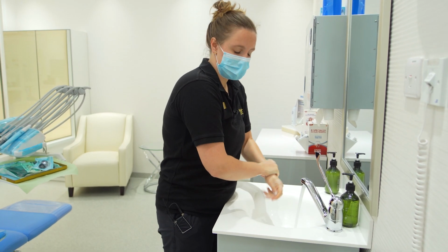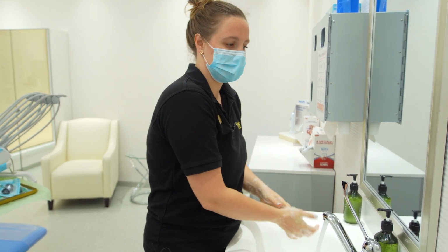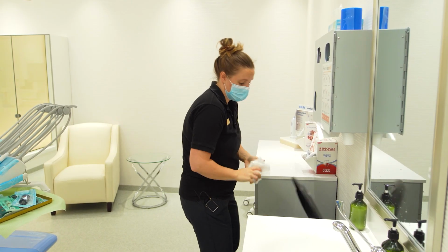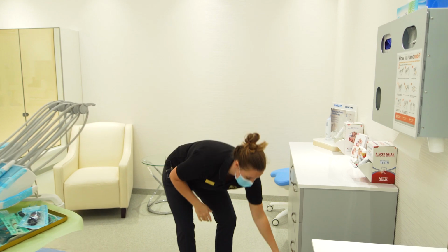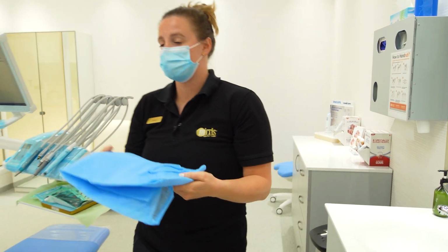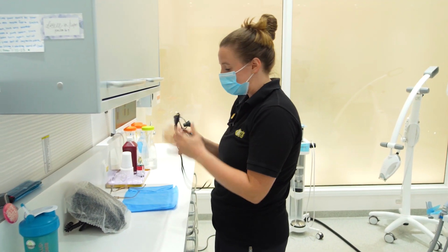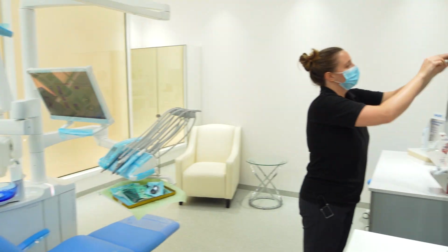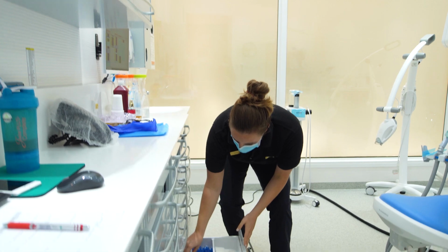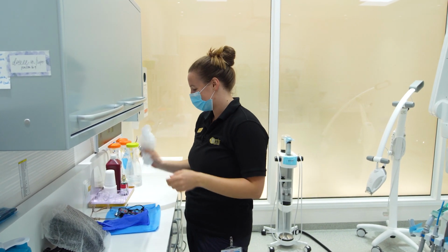So I've got my first patient in a few minutes, so I'm just gonna prepare my room and lay things out, take a look at the schedule. Since we are in a pandemic, we have to add a few things into our everyday PPE. We have disposable gowns for each patient. I have a shield. I still use my loops, obviously a mask, and I'll even grab some gloves out. Oh, can't forget my favorite cute little hat. Doesn't look very good when I have my bun in, but it's okay, it works.